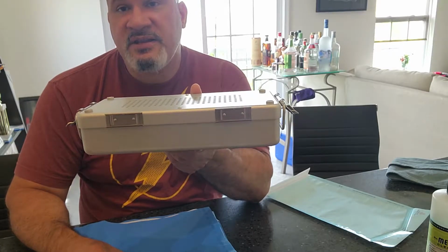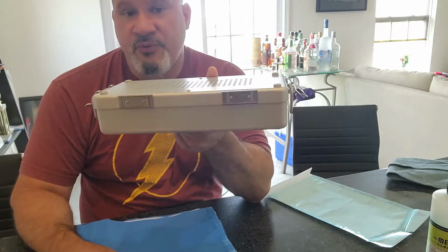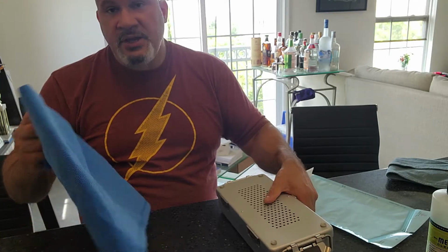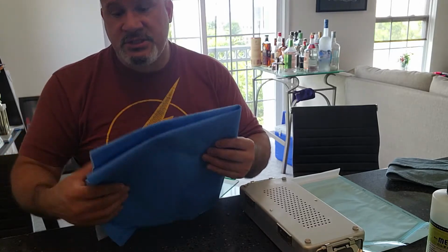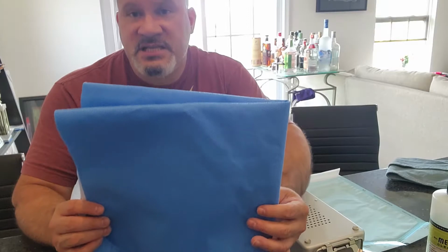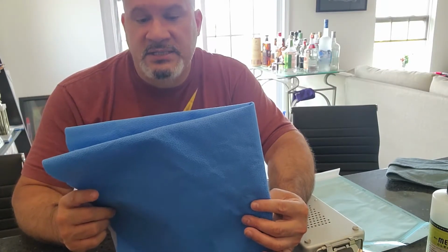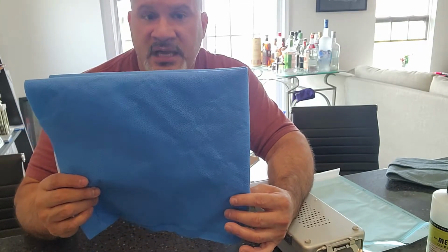This one here hasn't been validated for a hydrogen peroxide system. You have to have a special container for it, for this company. Not all of them, but for this company. I knew that this can go in both hydrogen peroxide and steam sterilization. What I didn't know is that it can't go under every temperature of a certain type of steam sterilization, and I'm speaking to gravity cycle specifically. I can't use this under every temperature in gravity cycles.